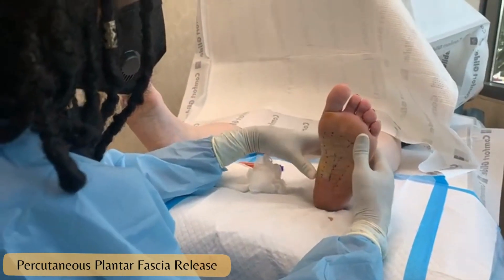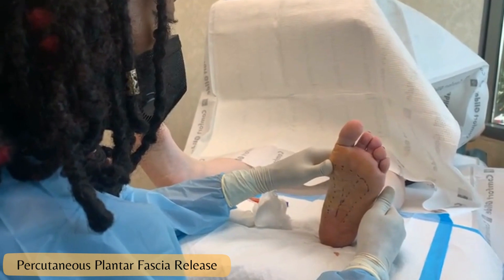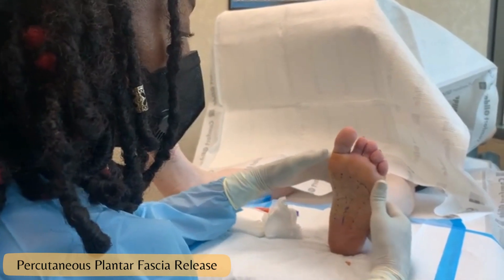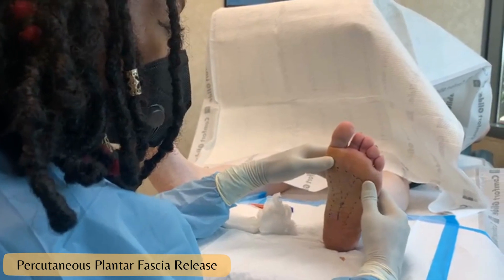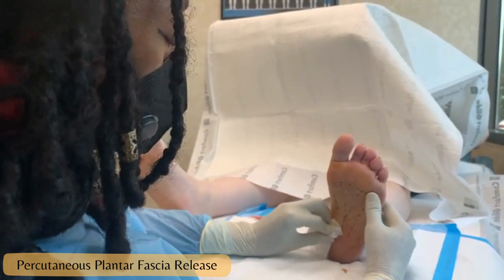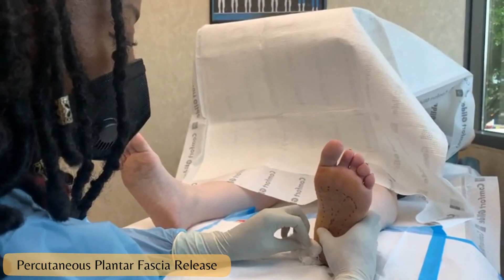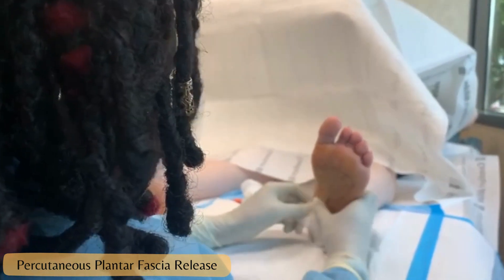The patient has been suffering with plantar fasciitis for some time. She's failed the anti-inflammatory injection and inserts in the shoes, so now we're at the last resort, which is surgery. Today we're doing a percutaneous plantar fascial release. We've already numbed the patient — lidocaine at the ankle and local lidocaine with epi at the foot to reduce bleeding — and we're about to begin.